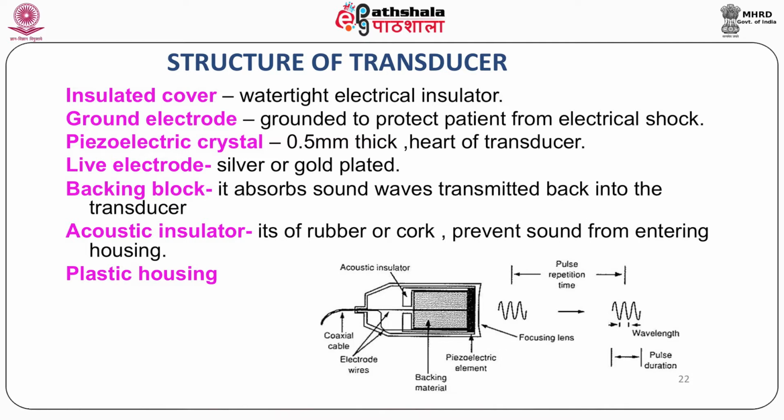The front and back of the crystal are coated with a thin conducting film to ensure good contact with the two electrodes that will supply the electrical field that is used to oscillate the piezoelectric crystal. The outside electrode is grounded to protect the patient from any electrical shock.